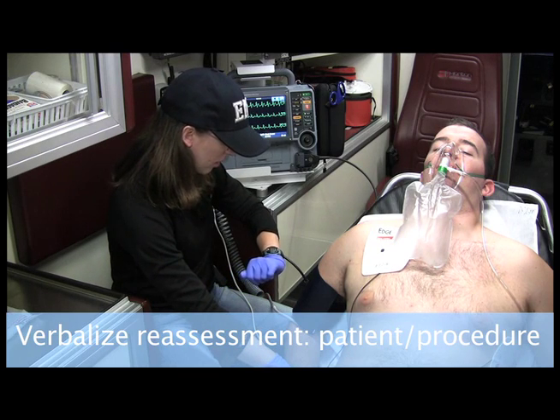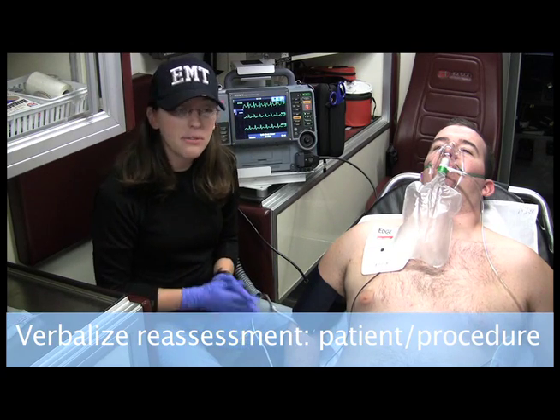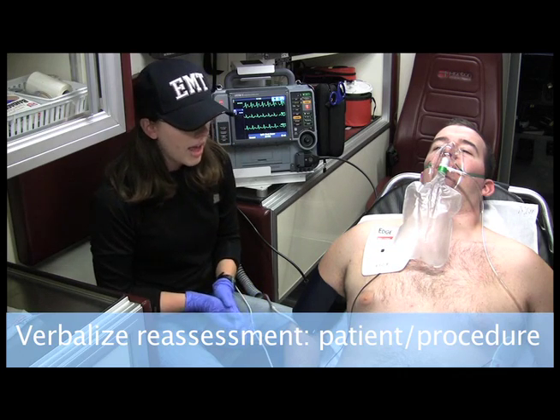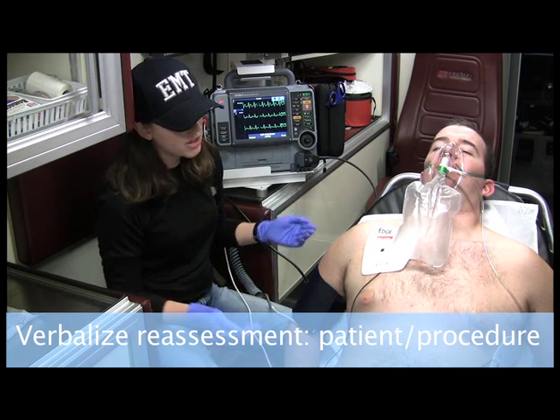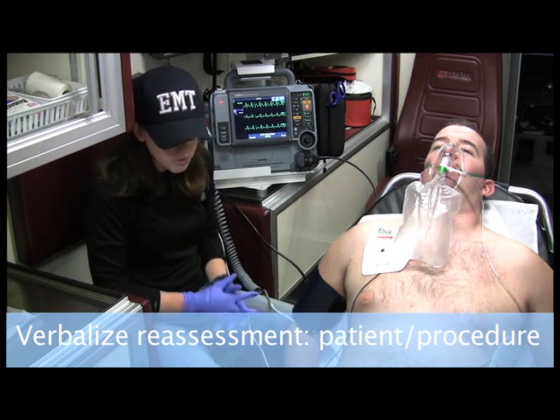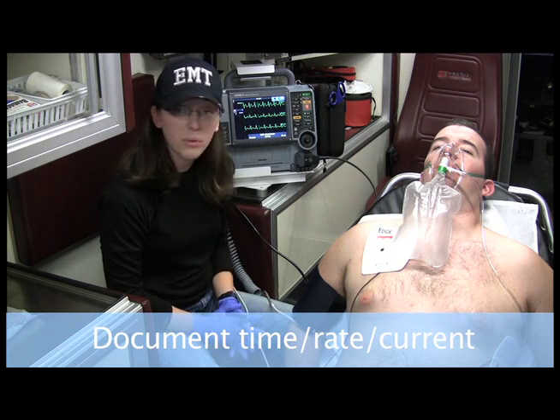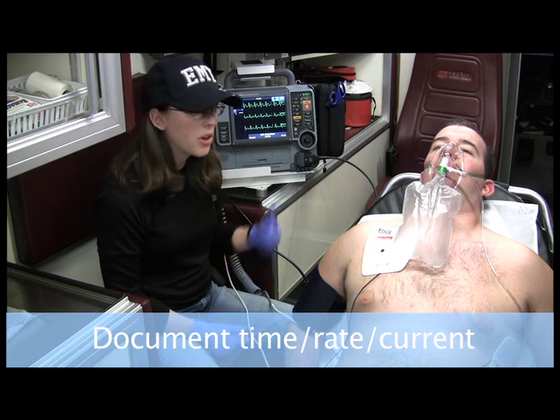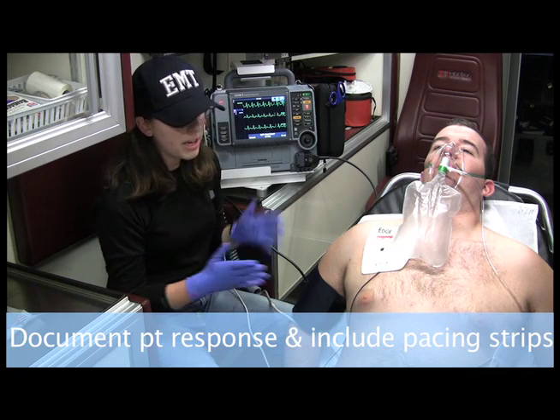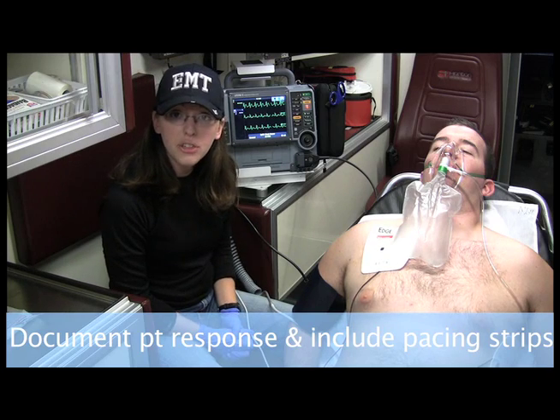The most important thing to do is, after I see capture on the monitor, I want to check the pulse to make sure I'm actually feeling 80 beats per minute. I'll check that for the correct amount of time. It's also important to get vital signs every five minutes on this patient because this is an unstable patient, and I want to assess the patient's response to the treatment. After the call, I want to make sure I document the rate, the time, the current that I set up the pacing at, the patient's reaction, and any other pertinent information to the call.